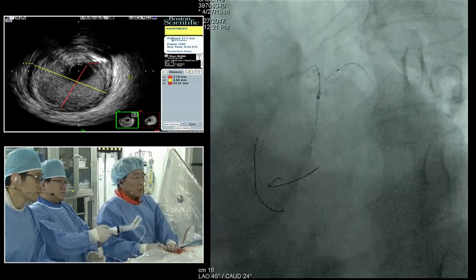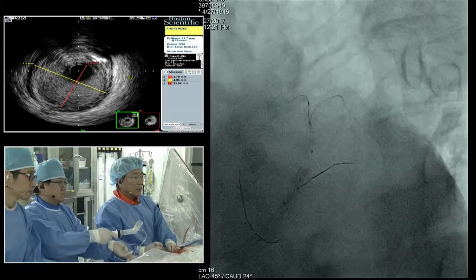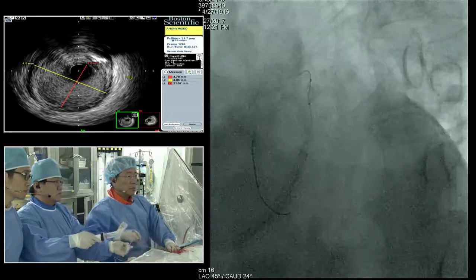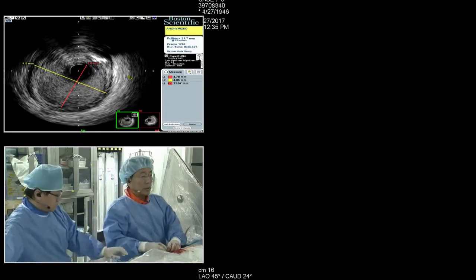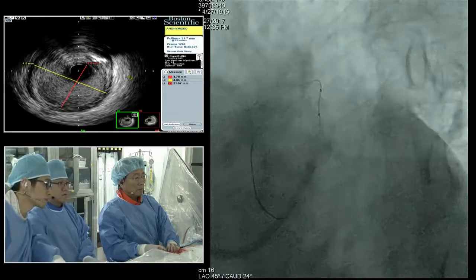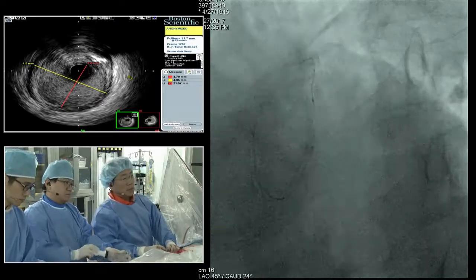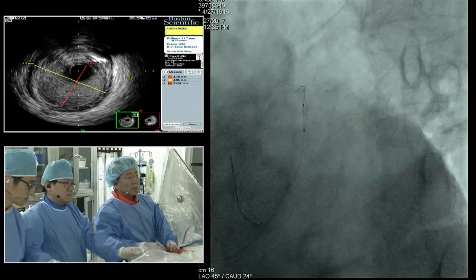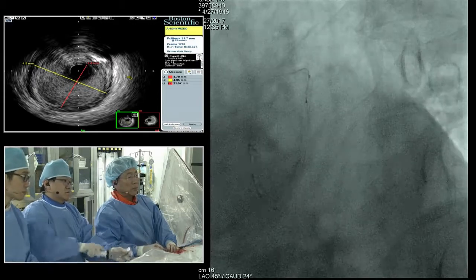So the reason why I really prefer the mini crush is quite simple, rather than the other technique. Just deploy the stent. Test, please. Okay, inflate. LAD tight stenosis here. Deflate. And wire in and balloon in.